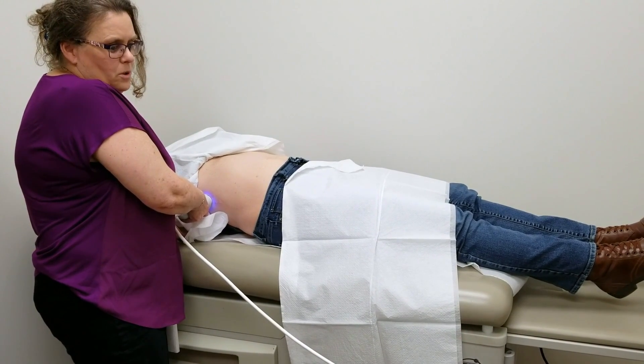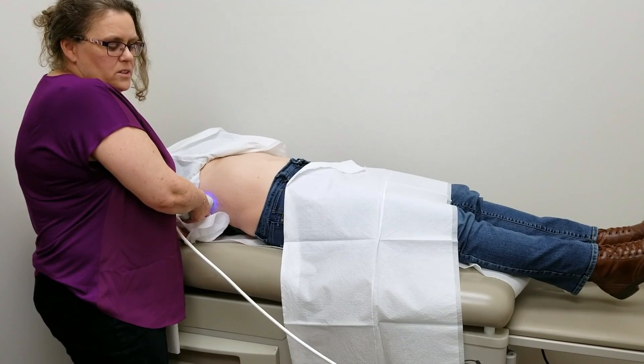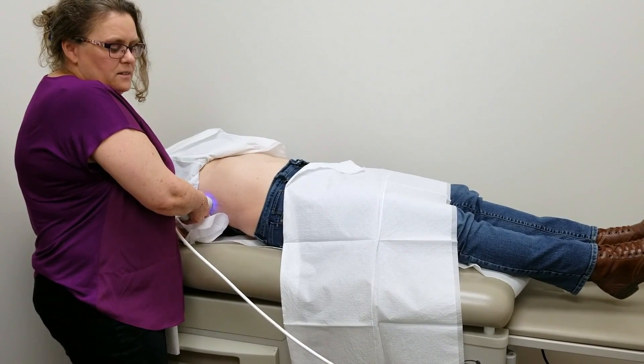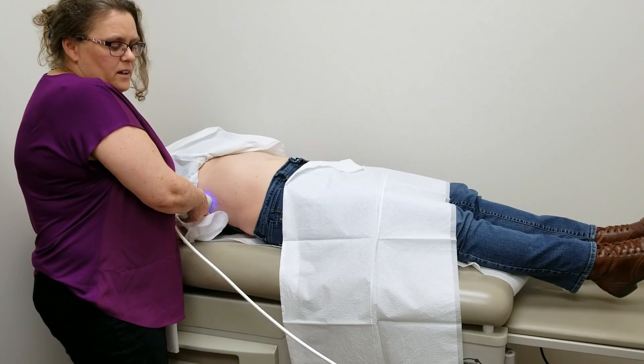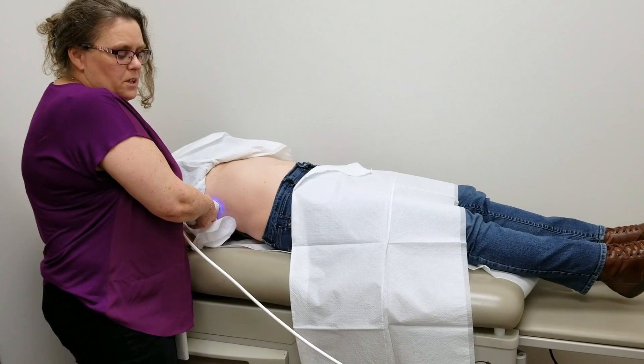We're getting really, really good waveforms for this patient, so I know it's an accurate scan, which will help the clinician interpret the results in a meaningful manner.